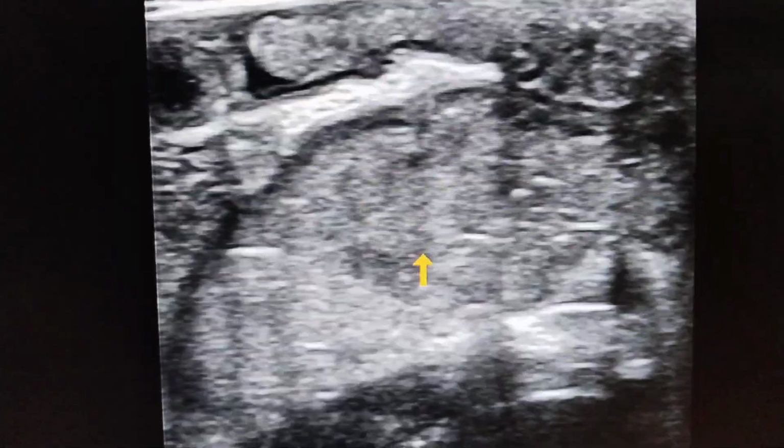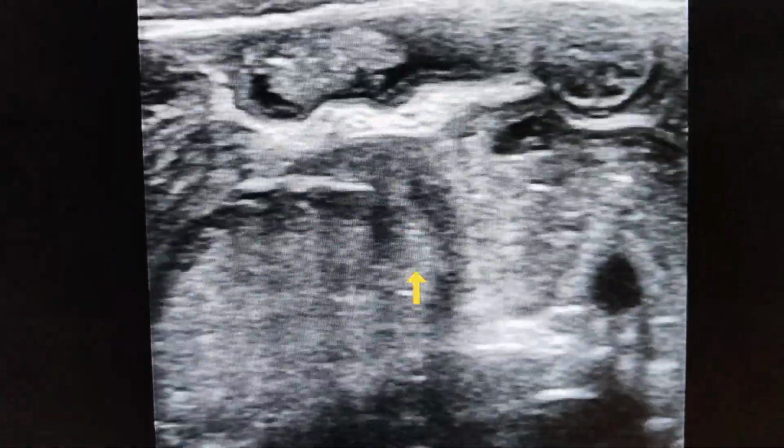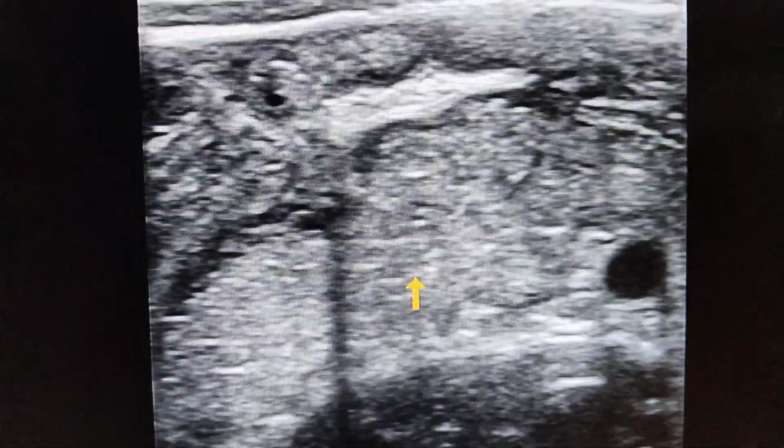So this was a case of intestinal malabsorption.